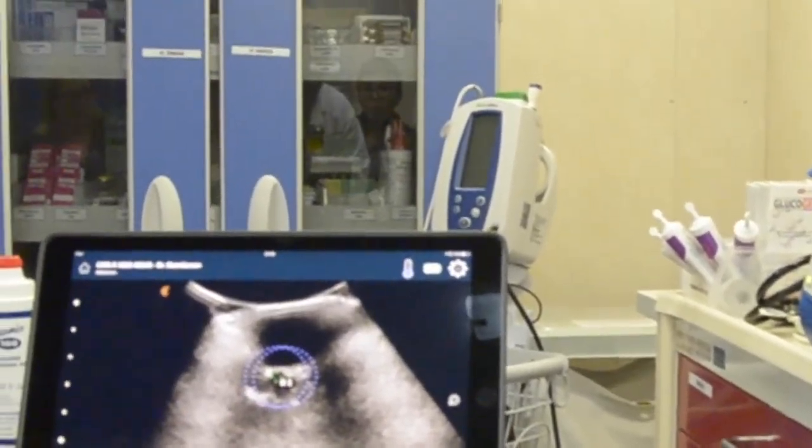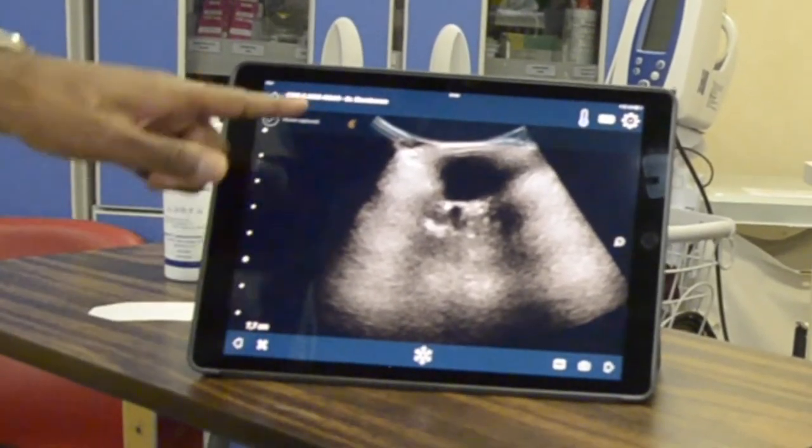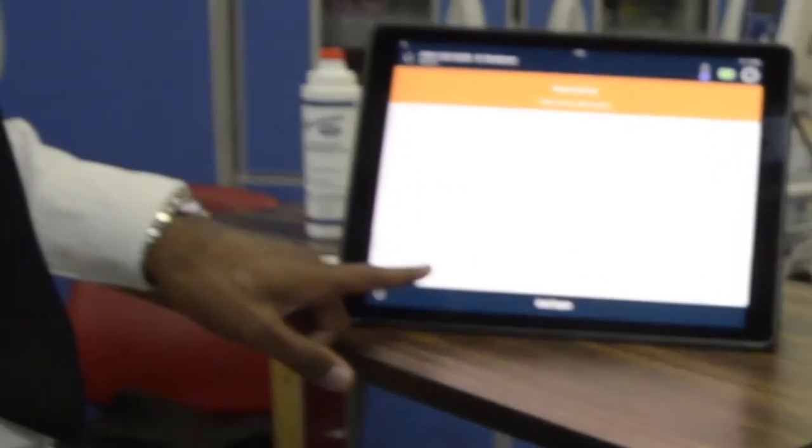It's less than three millimeters, so that means it's normal. You can also make a video — movie captured. That would be a loop from what we just did. Now we can submit, discard, or cancel — we'll discard it.